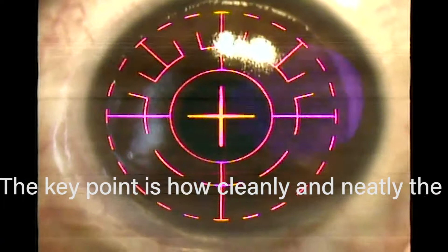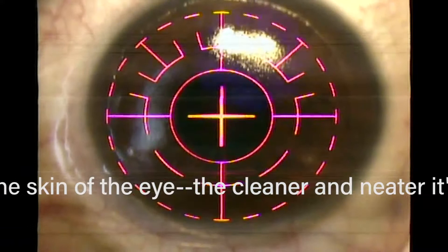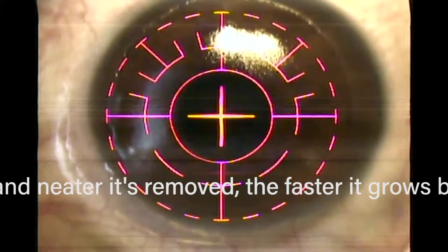It's non-cutting. You can see the skin comes off so atraumatically that no skin cells die on the cornea, and that's why it's totally painless afterwards. We don't put the skin back anymore — I used to put the skin back about 10 years ago. But then we did some studies showing that if you take the skin off and leave it off, you get new skin quicker.